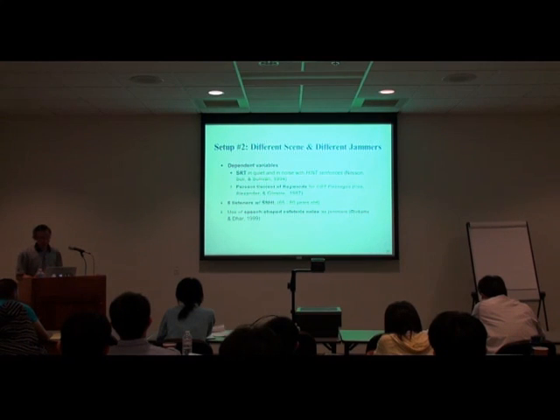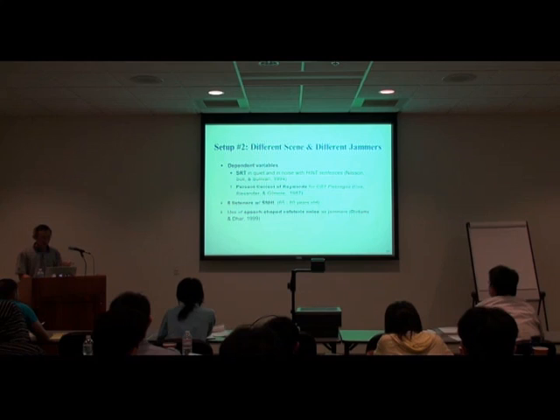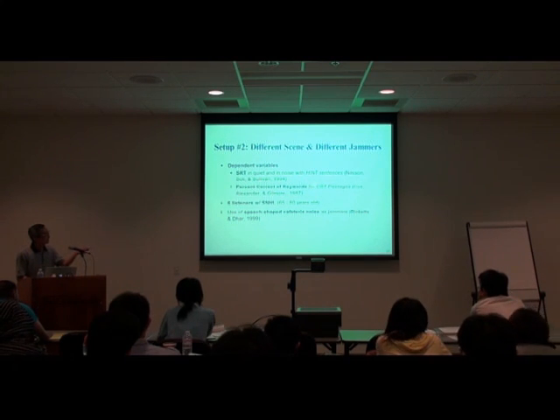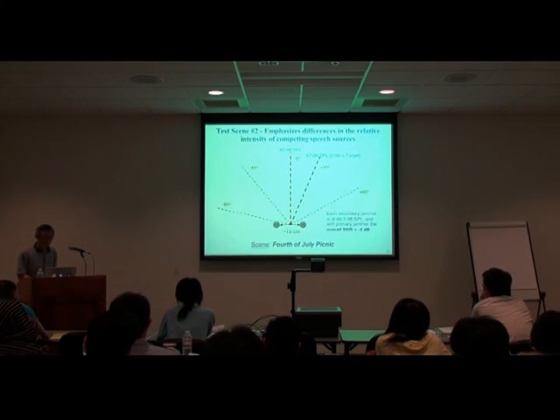And so as you can see, we have done a lot of scientific testing, with different scenes, with different jammers. This time we used speech-shaped cafeteria noise, which is also a very powerful jammer, and different passages, different sentences, and listeners with normal hearing or with sensorineural hearing loss.